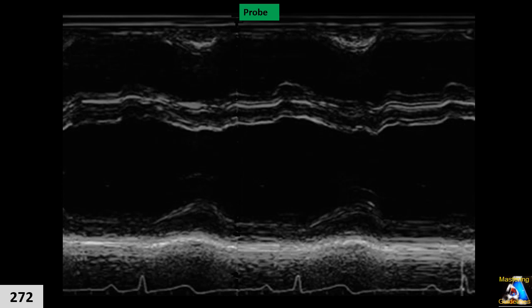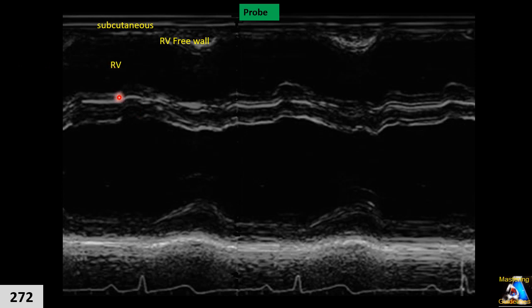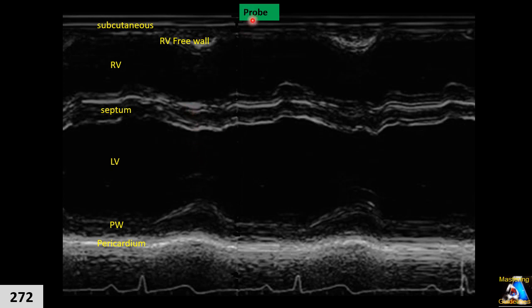Now let's see the normal pattern of the left ventricle M-mode. In a normal situation, the M-mode of the left ventricle has this characteristic pattern. From top to bottom we have: probe, skin and subcutaneous tissue, right ventricular free wall, right ventricle, septum, left ventricular cavity, posterior wall, and pericardium. During systole, the septum starts contracting and thickening, moving toward the left ventricle — or away from the transducer.